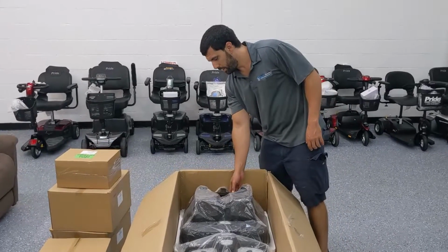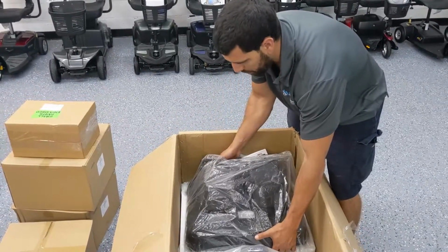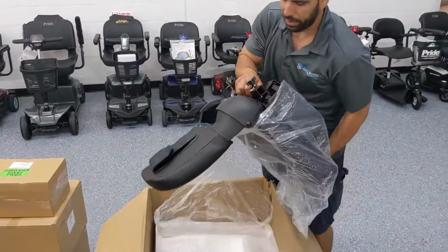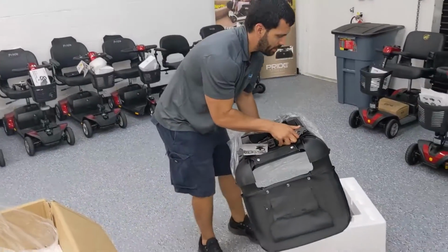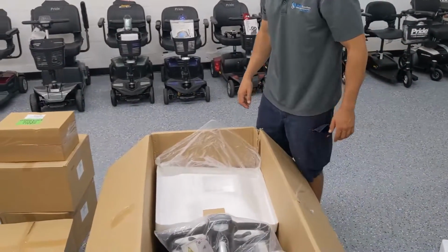All right, so as you can see, the seat is actually here. It's upside down, resting on top of another piece of styrofoam. So the next step would just be to kind of pick the seat up and then put it down somewhere to the side. Maybe rest it on top of the styrofoam so it doesn't get scratched. That's what we'll do here.